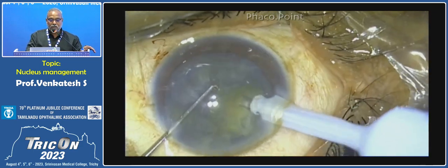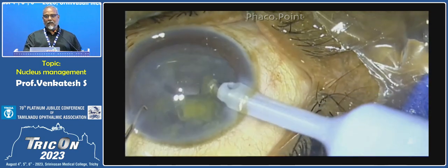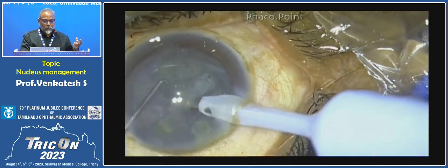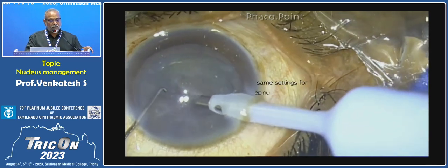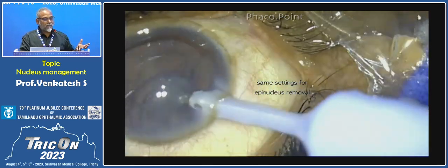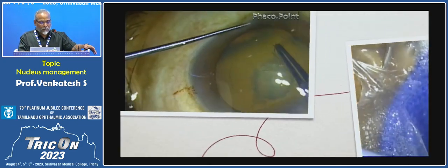The advantage of having a capsular rexis of this dimension is that it will enable you to push the intraocular lens into the bag. There will be a good overlap of the optic by the capsular rexis edge, which will again give you better postoperative results, better centration, etc., over a long-term period than employing a larger size capsular rexis. The epinucleus is removed with the same parameters.